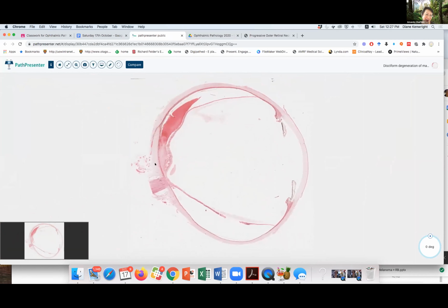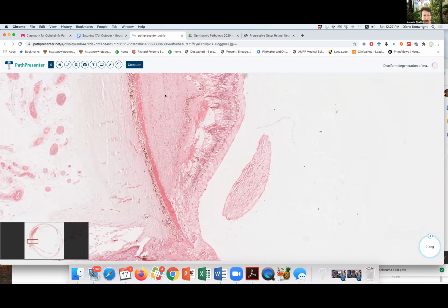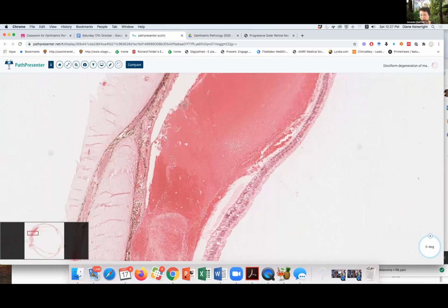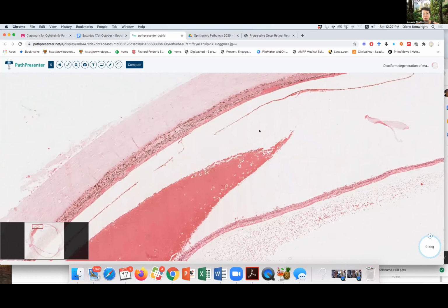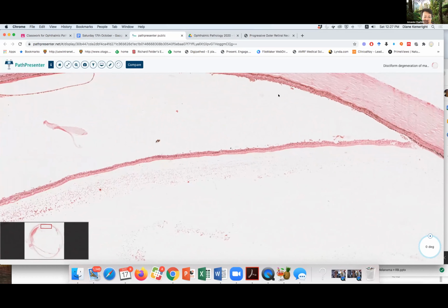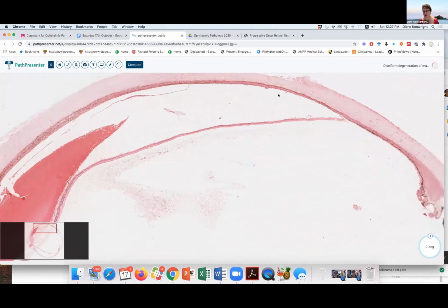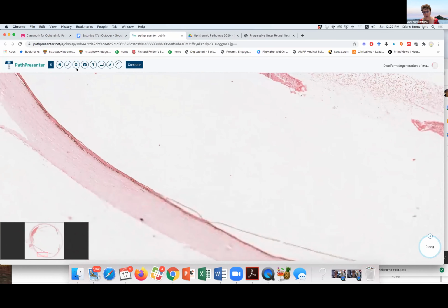I think it's just a really nice demonstration of the pathology, isn't it? Right, are there any more questions on the chat about this one? So Chris says they were thinking ARMD too, but couldn't find any drusen. Are drusen necessary? And I was wondering, could this be those diffuse soft drusen, like the basal linear deposit? I don't know. I can't see drusen either. I'm just having another look, but no, I can't see any drusen.